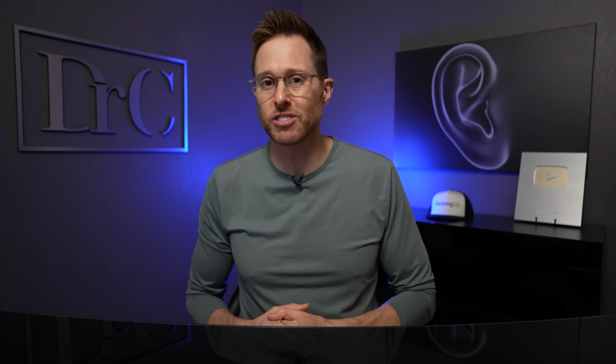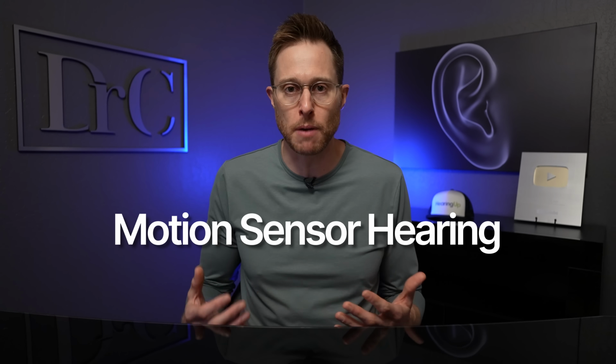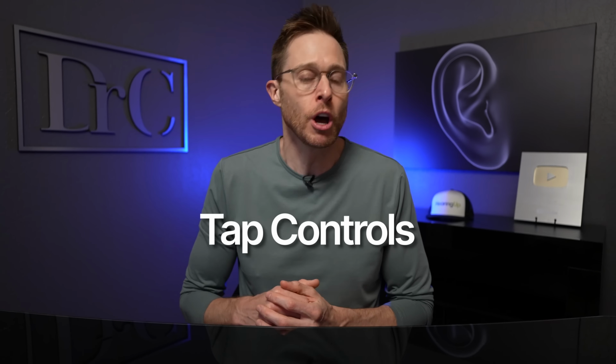The Infinio hearing aids do have a motion sensor still inside of them, which allows you to have access to motion sensor hearing, which will adjust the directionality of your microphones based on when you're sitting or when you're walking. And it also gives you access to tap control functions to either answer the phone, hang up on a phone call, or activate your voice assistant.